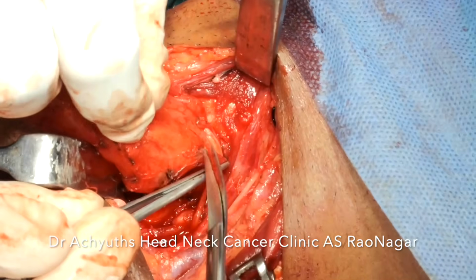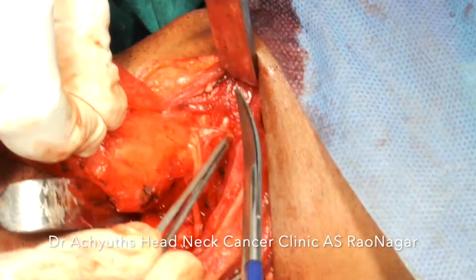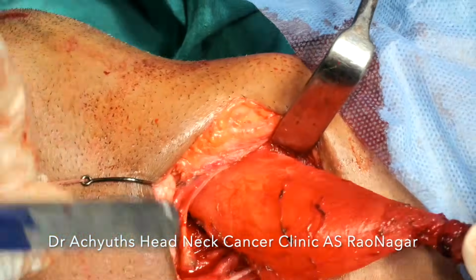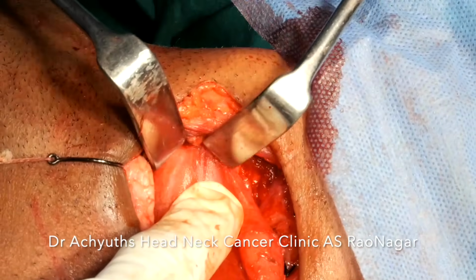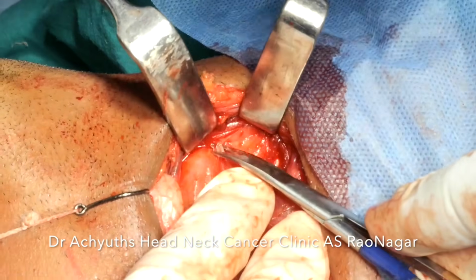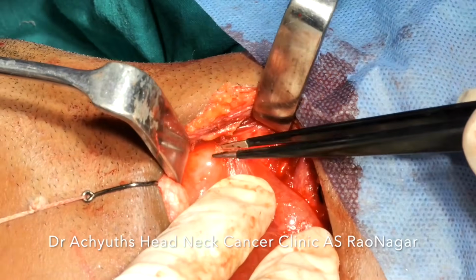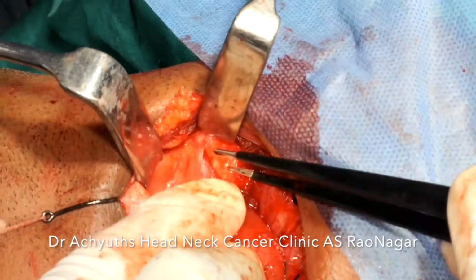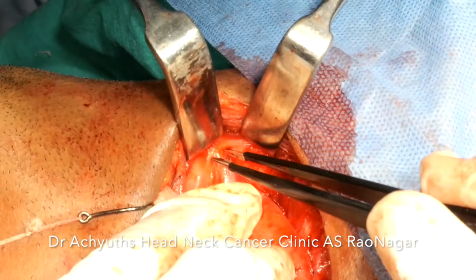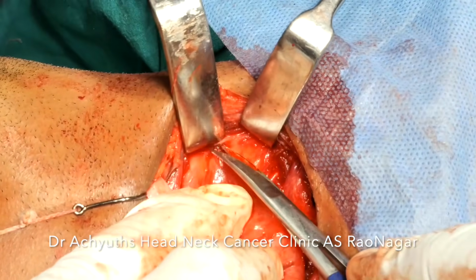I am using a dissection or a vascular forceps to hold the structures. Sometimes, unfortunately, other than holding the structures, we cannot give them traction. So we can parallelly use some vessel loops or use a skin hook to retract them. So here we are directly trying to enter the paraglottic space.